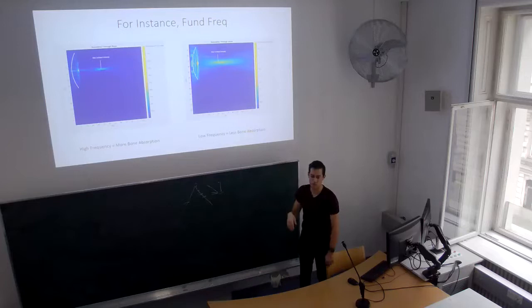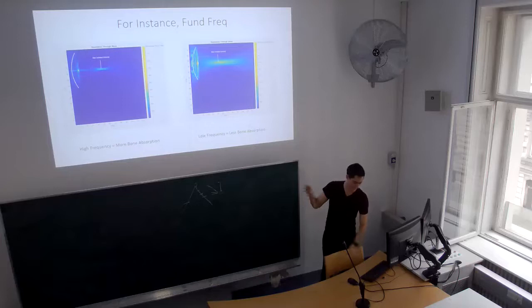Okay, so in animals, you can get away with really high frequency because they have little skulls sometimes, like a rat, right? But you want to be super precise. Humans, you have to do this in-between thing because we have really thick skulls. Not really relevant to safety, but I'm going to talk about that.